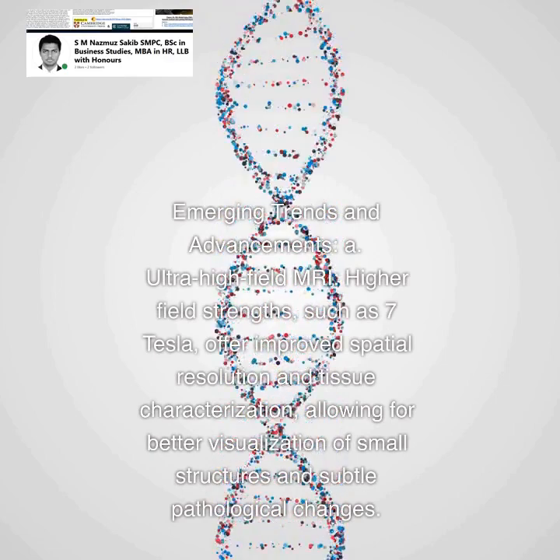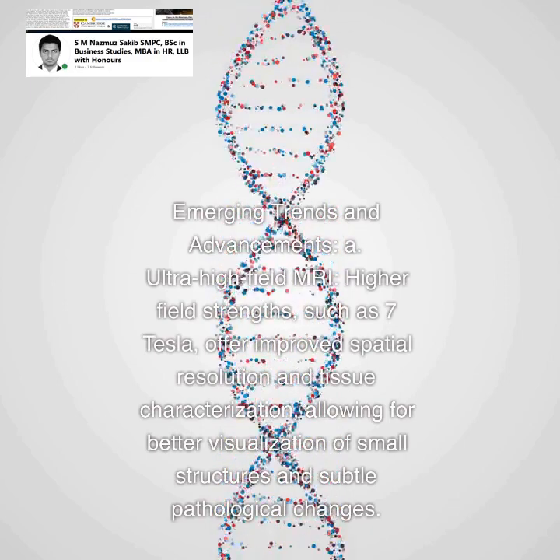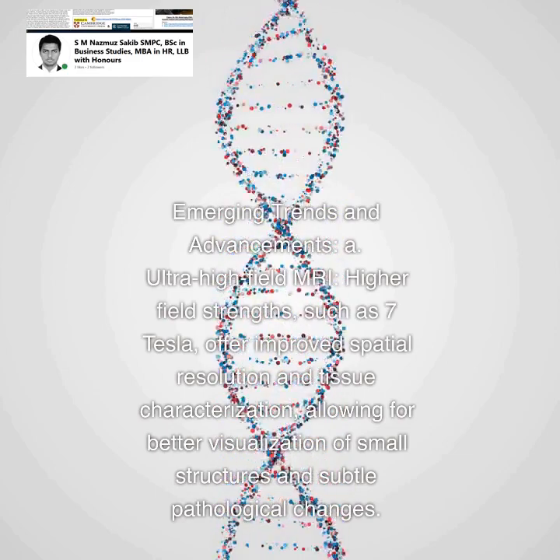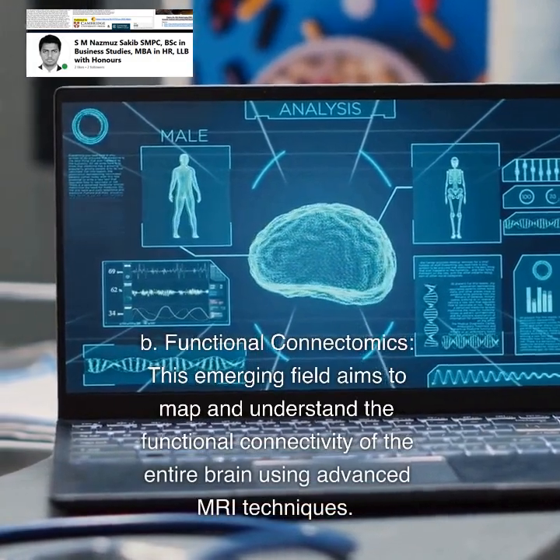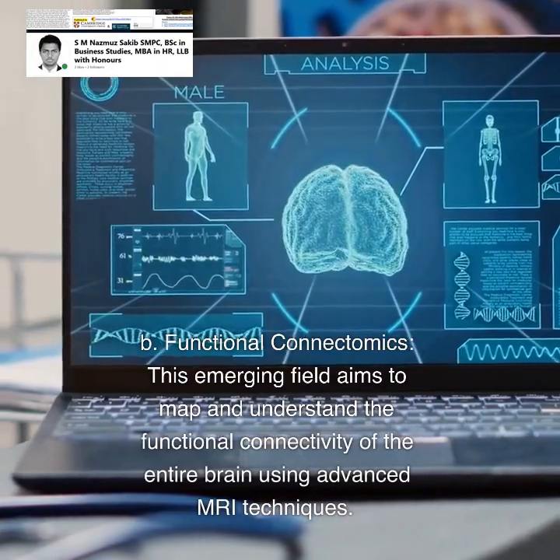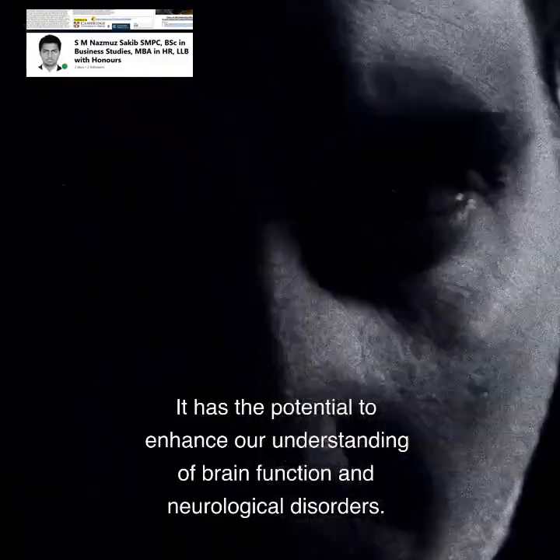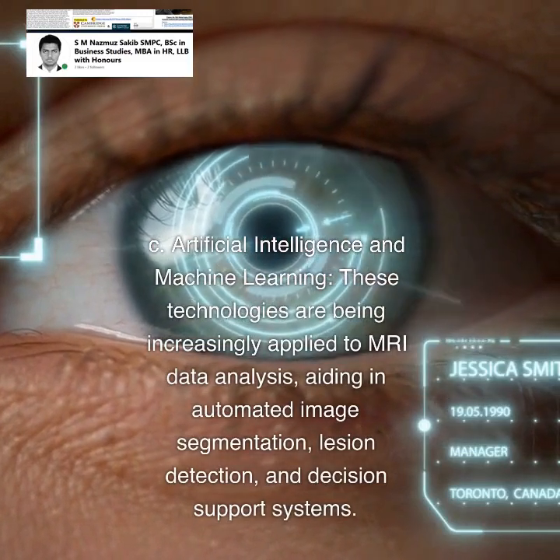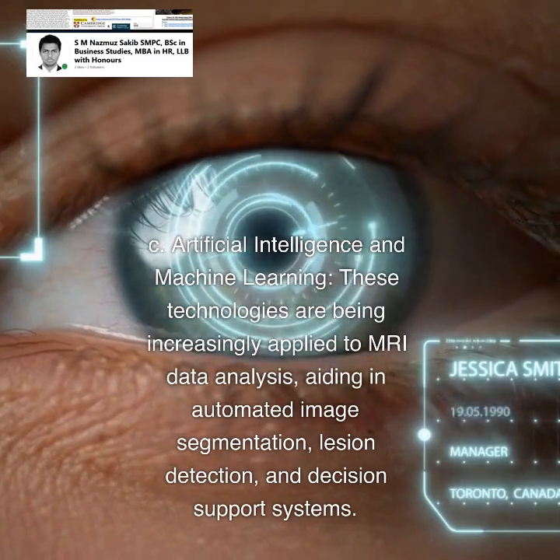Emerging trends and advancements. A. Ultra-high field MRI. Higher field strengths, such as 7 Tesla, offer improved spatial resolution and tissue characterization, allowing for better visualization of small structures and subtle pathological changes. B. Functional connectomics. This emerging field aims to map and understand the functional connectivity of the entire brain using advanced MRI techniques. It has the potential to enhance our understanding of brain function and neurological disorders. C. Artificial intelligence and machine learning. These technologies are being increasingly applied to MRI data analysis, aiding in automated image segmentation, lesion detection, and decision support systems.